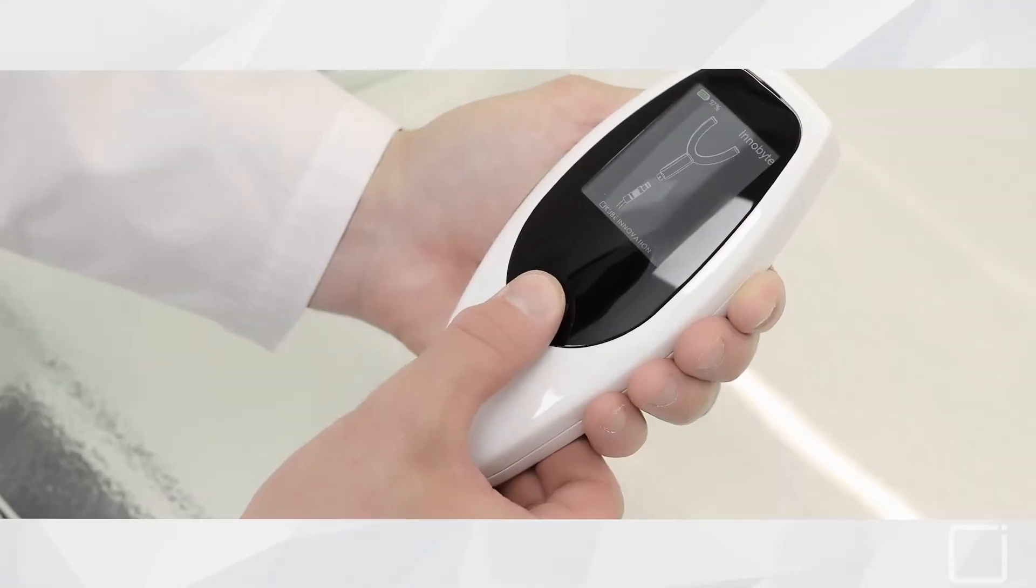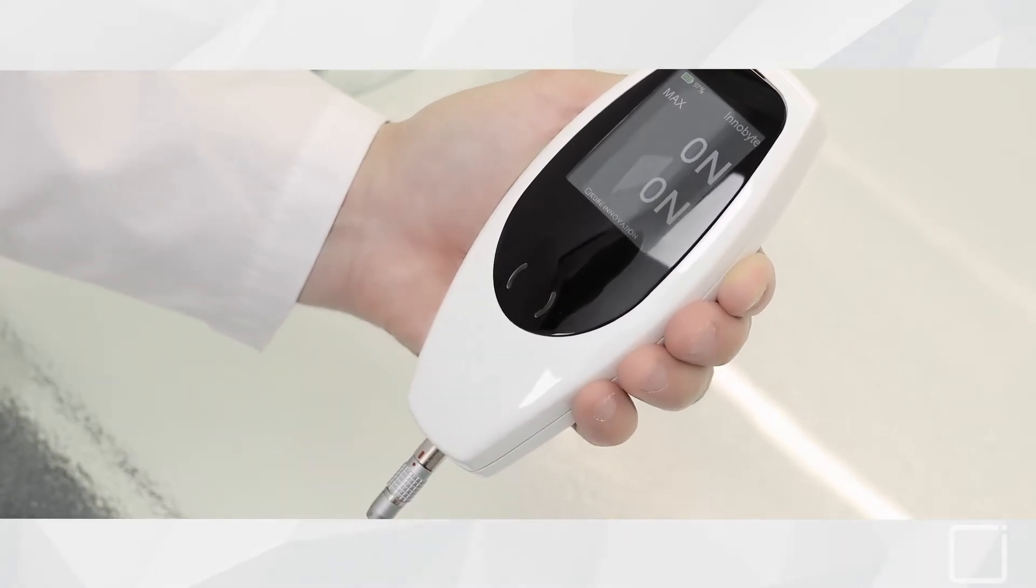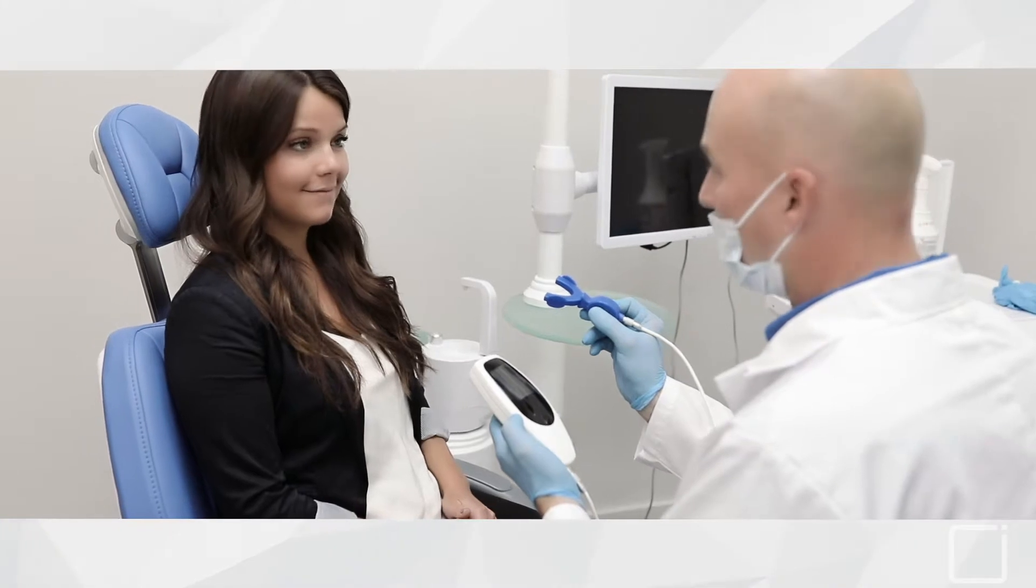Once the device is completely assembled, you will see two values of zero Newton. You may now proceed to your first ByteForce measurement.